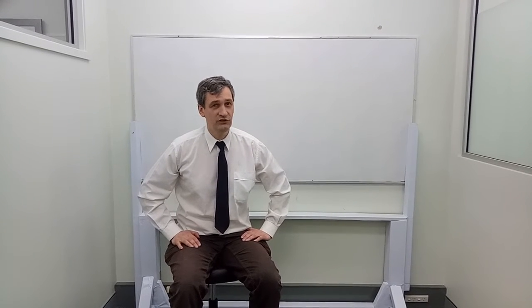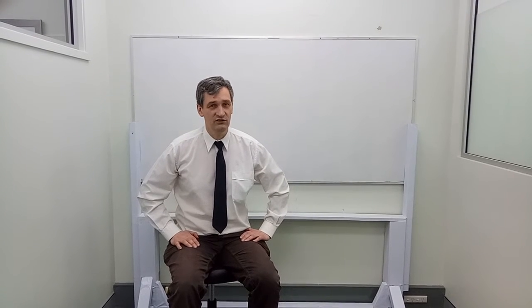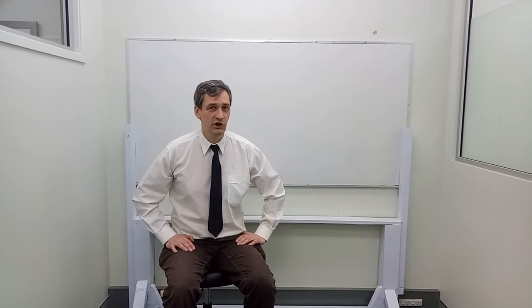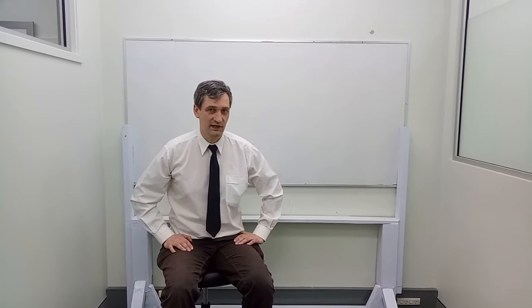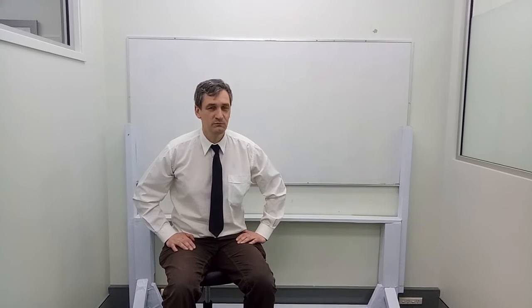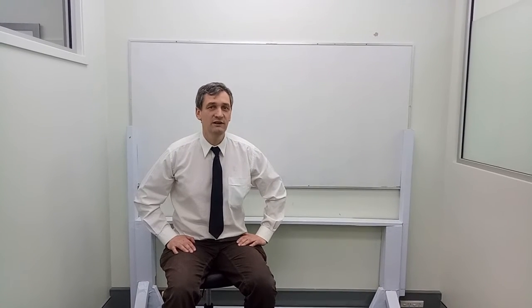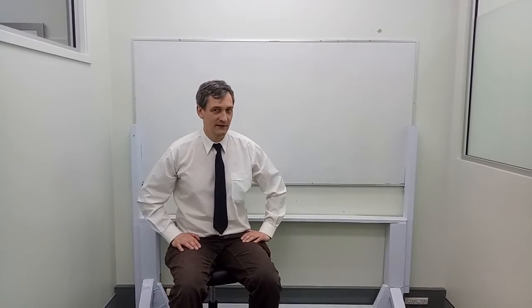The other type of fracture that you may face is a proximal phalanx fracture. In these cases, the extensor mechanism is going to tighten up distally, while the intrinsics and lumbricals are going to pull on the more volar aspect and the more proximal aspect, and that's going to create a volar apex fracture. In these cases, we strongly recommend that you bend the splint as much as possible distal to the fracture. So we're just going to demonstrate that now.